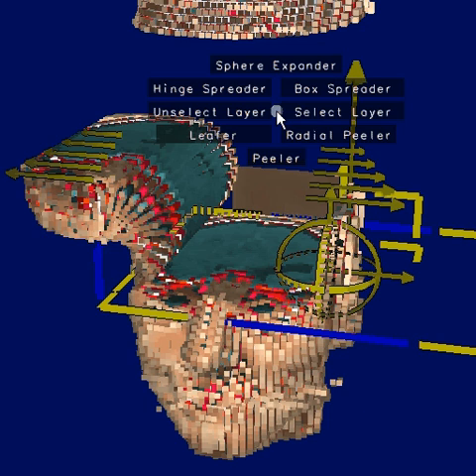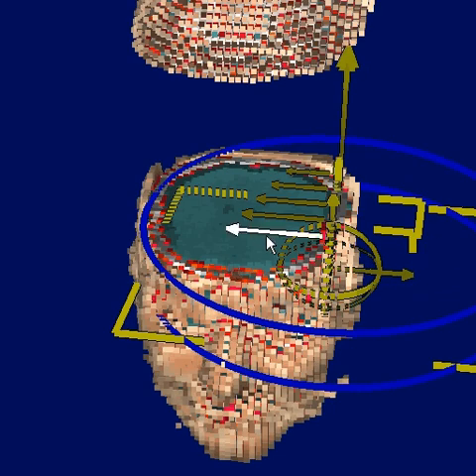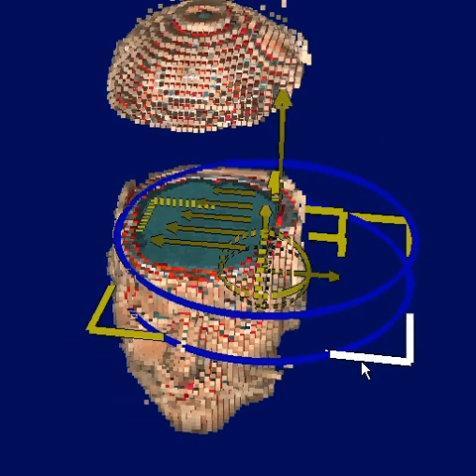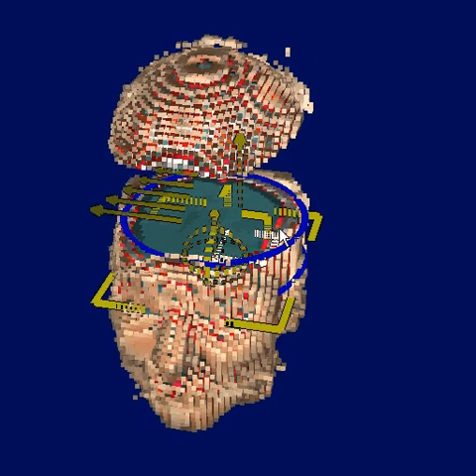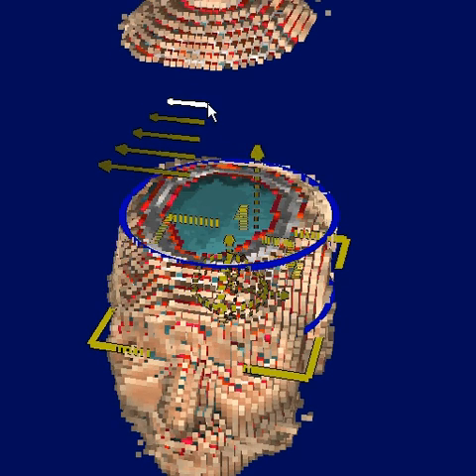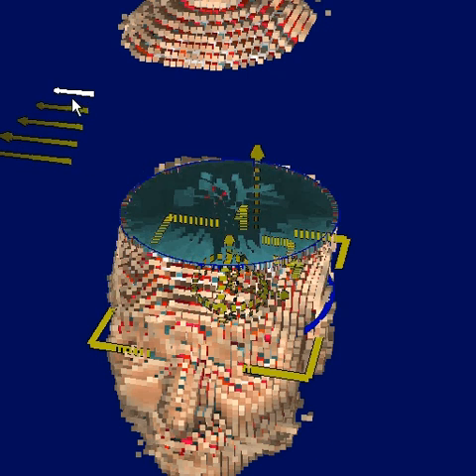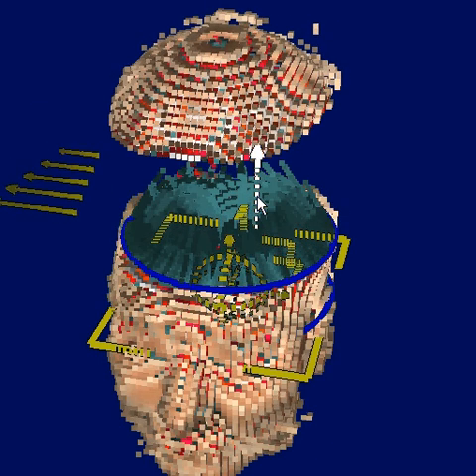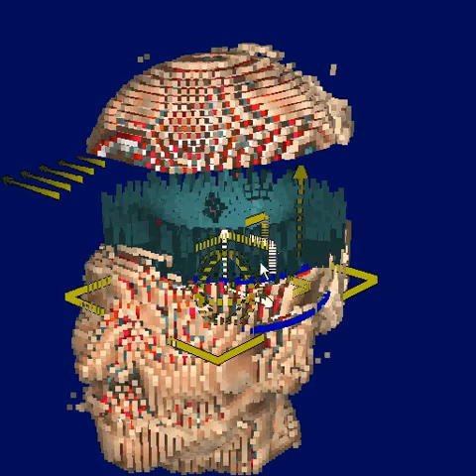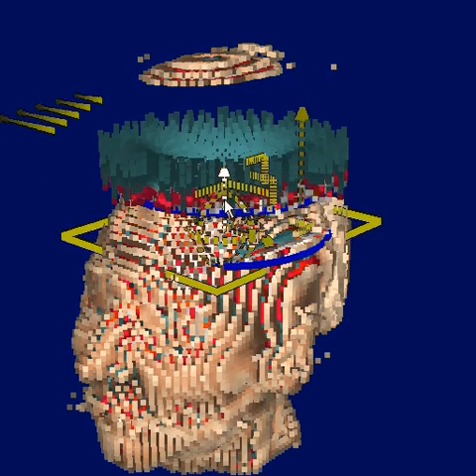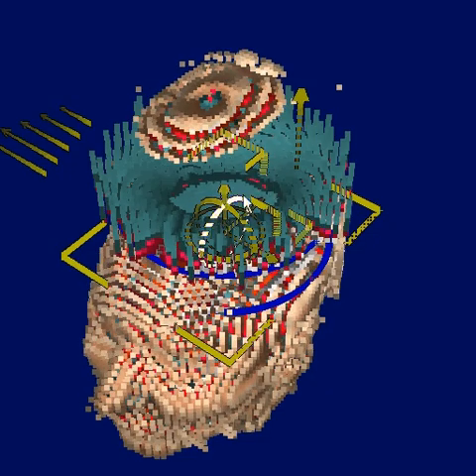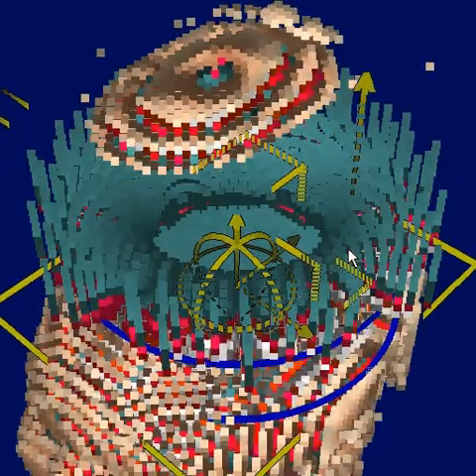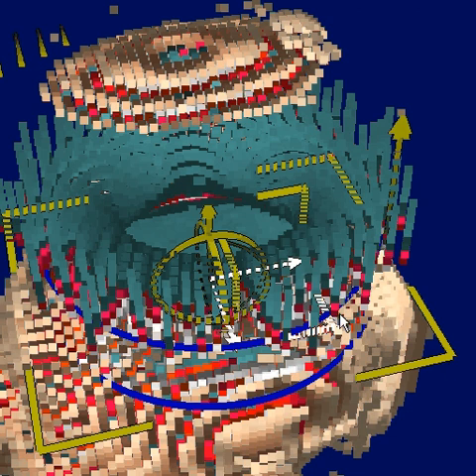We also have a variation on the peeler called the radial peeler. This tool is shaped like a cylinder. It has the effect of poking a hole through the axis of the cylinder and peeling the layers away from the center, almost as if the layers were being turned inside out. Once again, let's switch to high resolution mode.